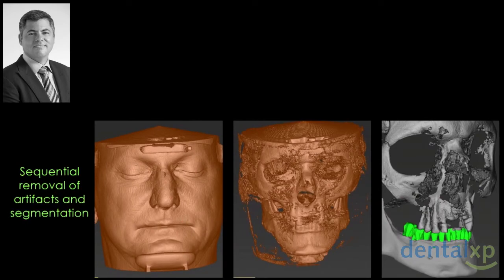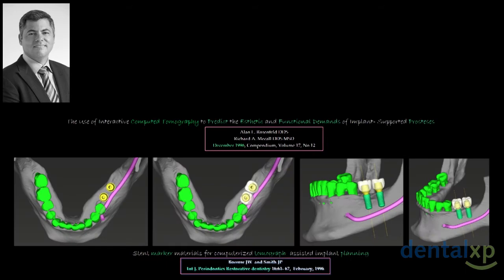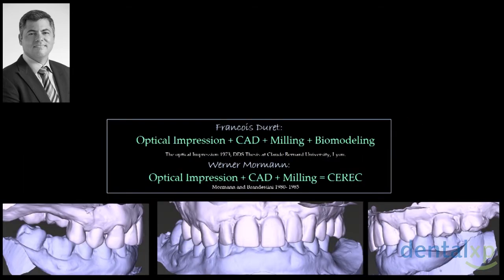Then originally we would get into cleaning by hand all these images that sometimes would have a lot of artifacts, and we would have to go into a process called segmentation, which was basically manually cleaning all this info. And from there, we would go ahead and do the planning of our implants, our virtual crowns, our abutments, and some of the anatomical structures. And we actually got pretty good at it, and it was almost an artistic type of work.